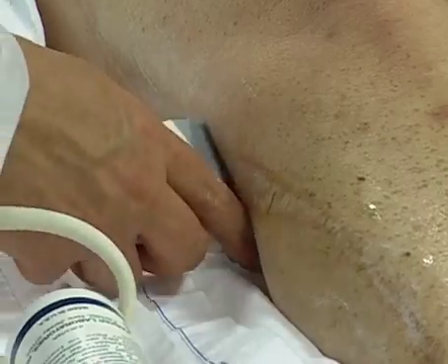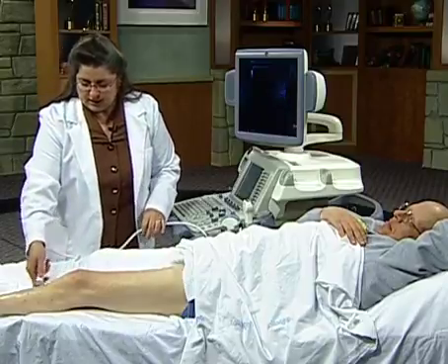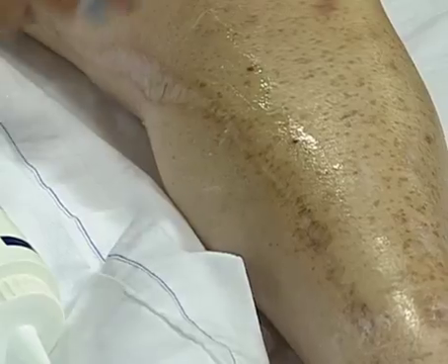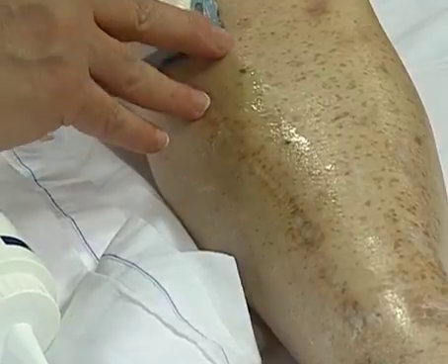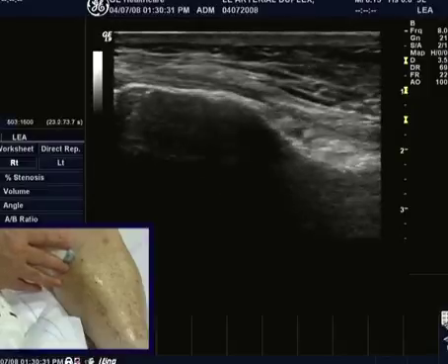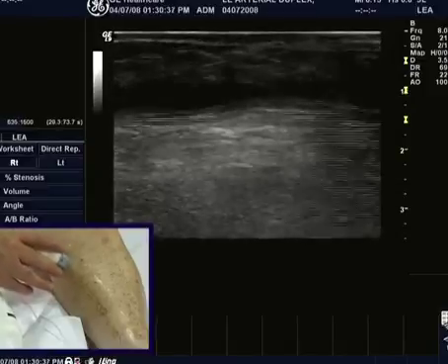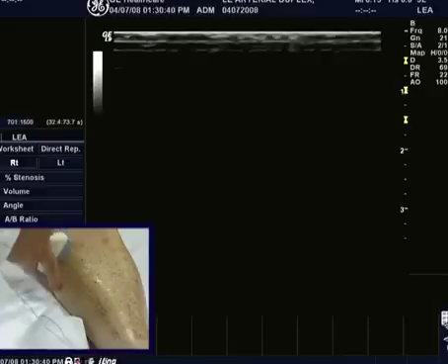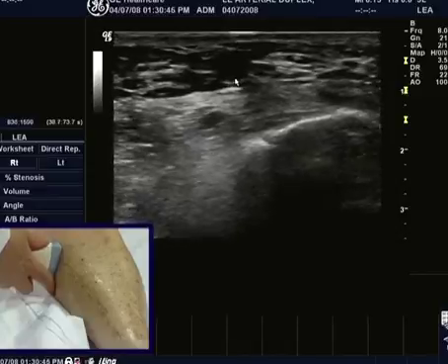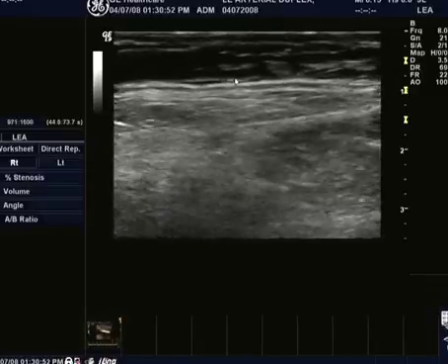And now we're coming down below the knee, and of course at this point the bypass is going to curve a little bit anterior, kind of coursing a little bit along near the tibia. One thing is, some folks find it hard to start out in a longitudinal scan and find the bypass, because here I am by his knee and I'm going to go back and forward and there it is. But it's also very quick to just put the probe down in a transverse fashion and wow, there's the bypass right there. No looking around, because we can see a broad range. So when we get it in view, then we can go long on it again and continue to follow.